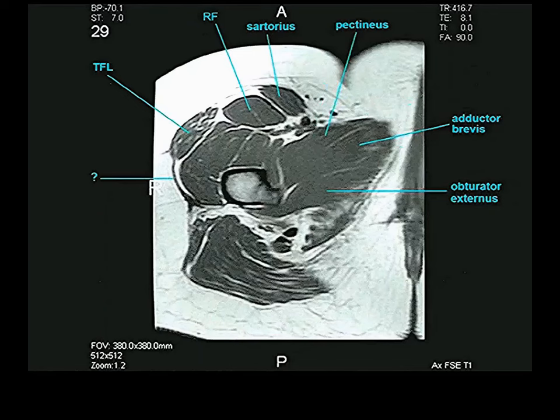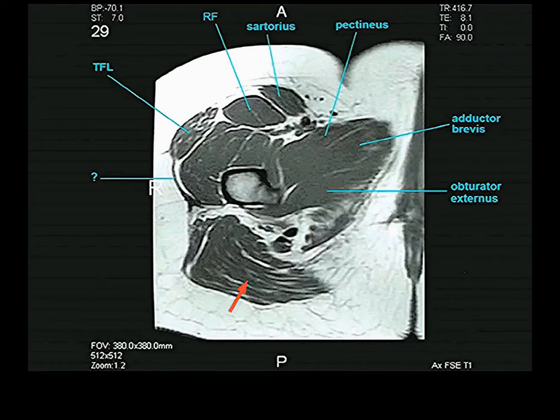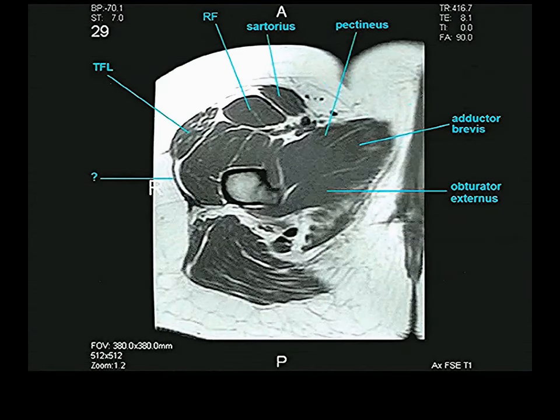A black structure between the tensor fasciae latae and gluteus maximus — that is the iliotibial band.